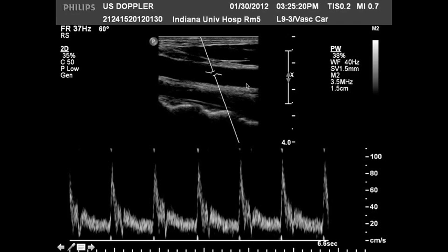This is another carotid. The patient's feet are on this side of the image and the patient's head is on the other side. If you have blood flow moving from their head to their feet, that's going to be moving towards this vector right here, and therefore that flow will be represented above the baseline as a positive deviation. The angle correction is important so that you can measure an accurate velocity.